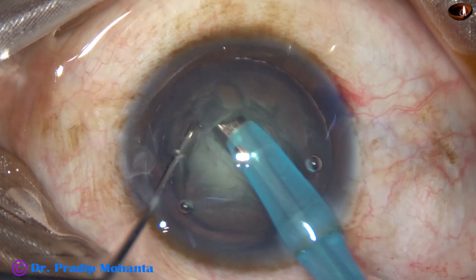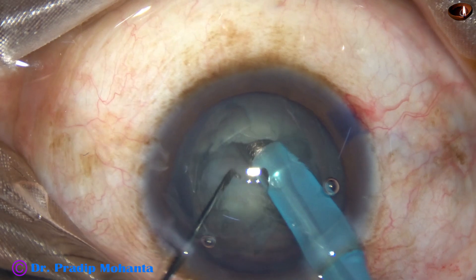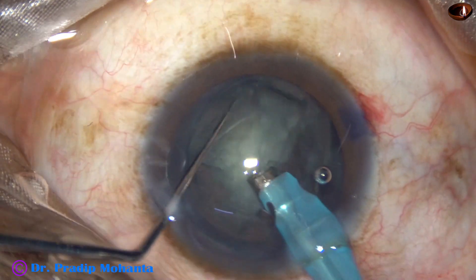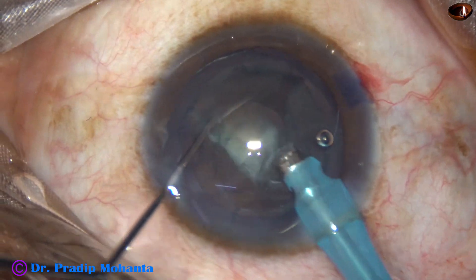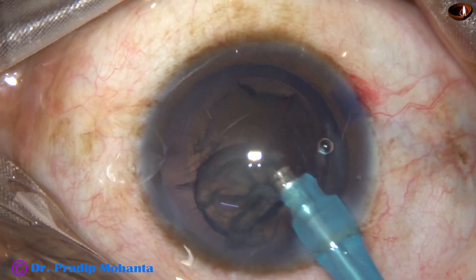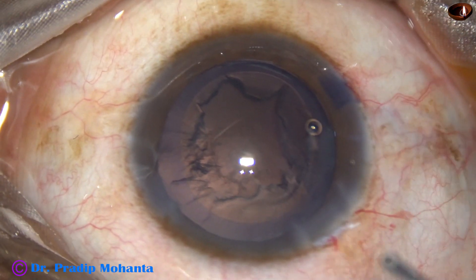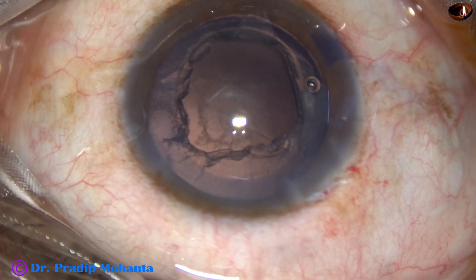A deep groove is made. The trench is deeper at the center and not so deep at the sides, and the nucleus is divided into two pieces. Each heminucleus is then subdivided into two fragments, and the fragments are emulsified. At this time, phacoemulsification is done in phaco-2 mode or quadrant removal mode where the vacuum is high — about 400 mmHg — flow rate is 40, and ultrasonic energy remains the same at about 50%.